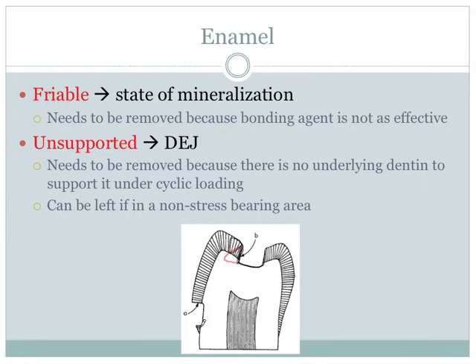They separate from each other as you move out towards the surface. That's purposeful, because of the orientation of the enamel rods. If we were to do the same convergent design and cut it like this, you can see again we're going to have unsupported enamel if we cut at the convergent angle.